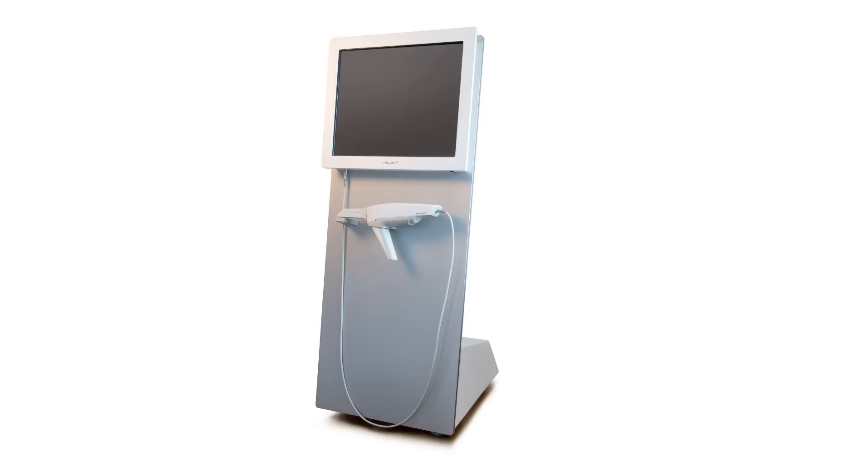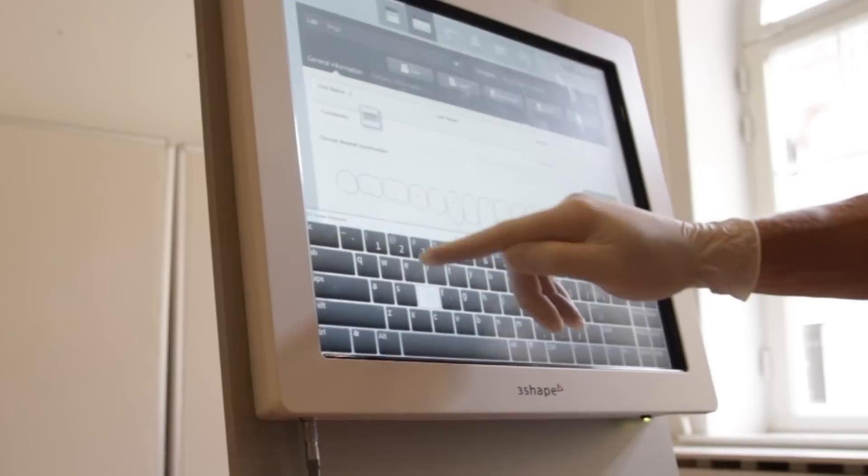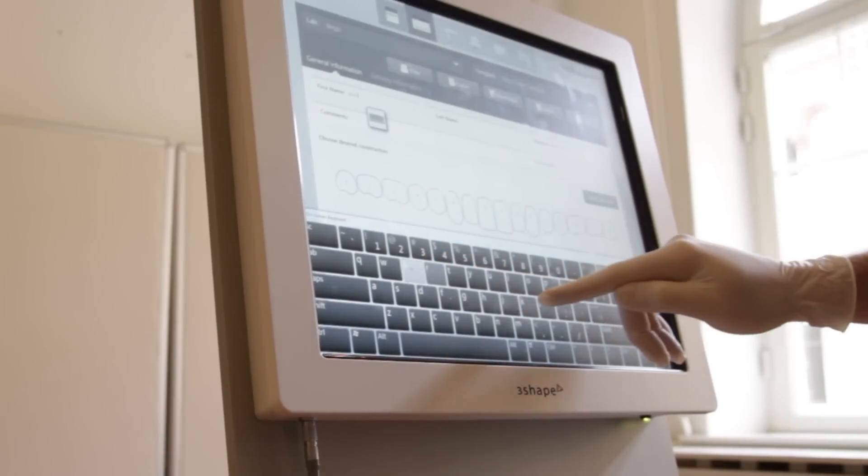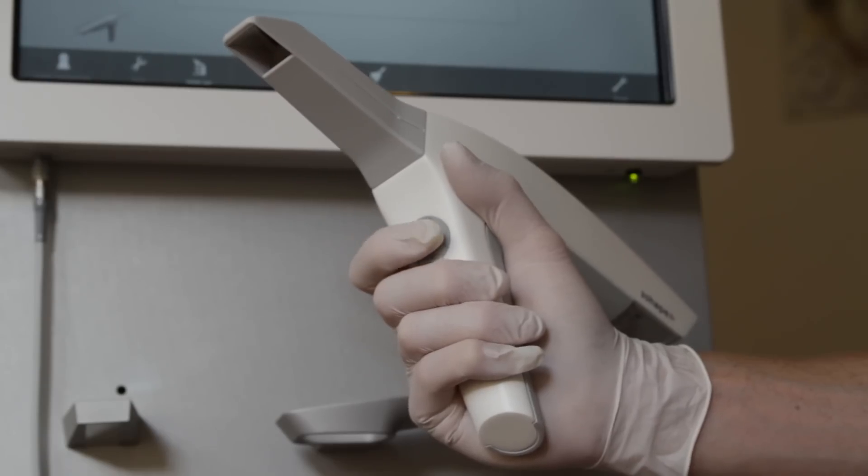The TRIOS system consists of a cart and a handheld scanner. The system connects to the internet via Wi-Fi. You operate the system through its touchscreen and by pressing the trigger on the handheld scanner.